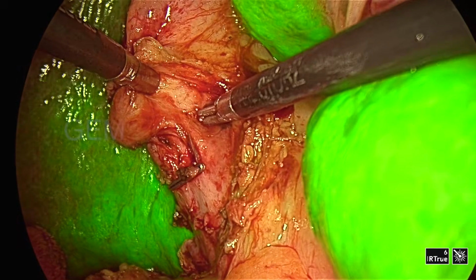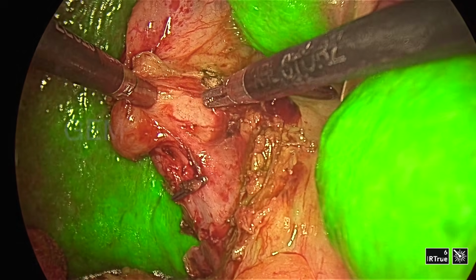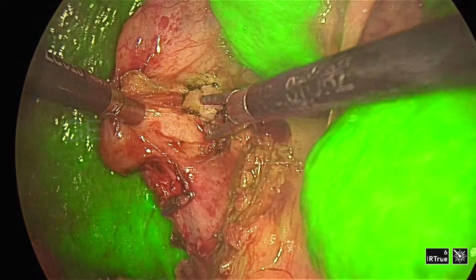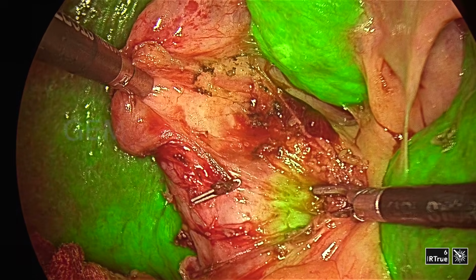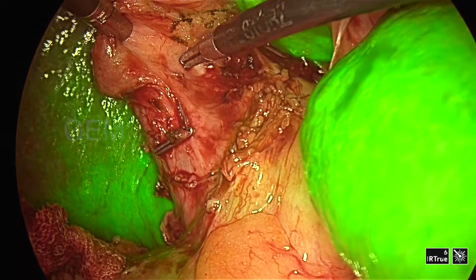Since ICG was given on the previous day, it has washed out from the venous and arterial circulation. Now you can see it's only in the biliary system. Now it is there.